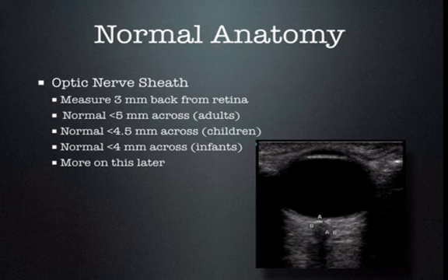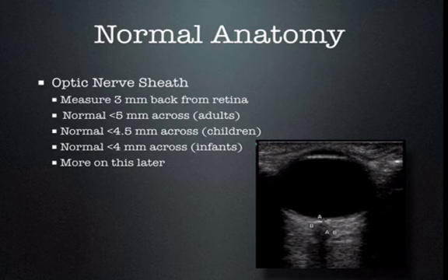The optic nerve sheath comes out the back part of the eye. To measure the diameter, we measure three millimeters back and then measure the width. The width can be somewhat challenging to measure unless the optic nerve sheath edges are very well defined. It does take a little bit of practice to get accurate measurements. Generally, you're going to vary between 0.2 and 0.3 millimeters even if you are very accurate, so there is a little bit of wiggle room in these numbers.